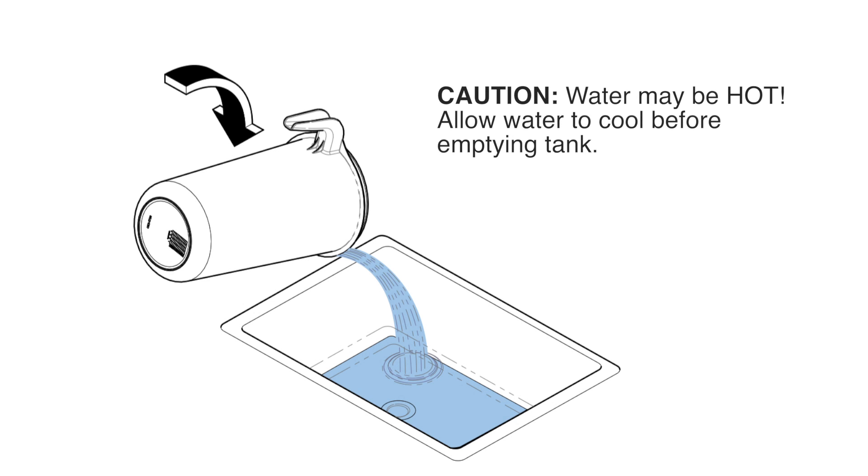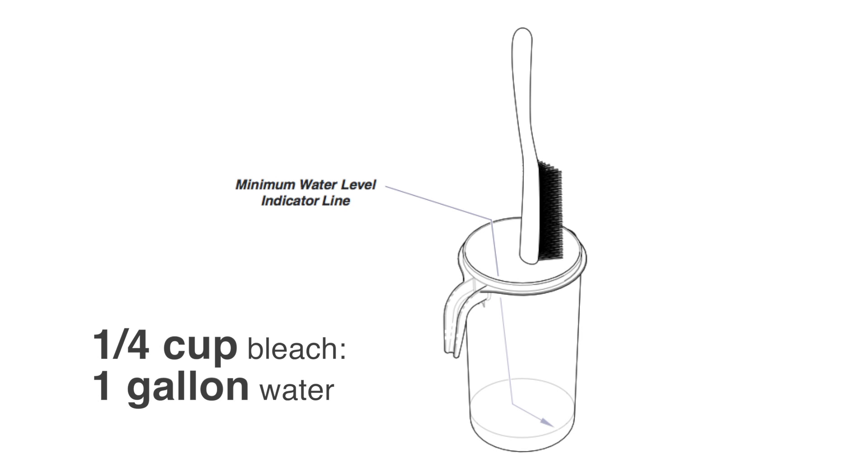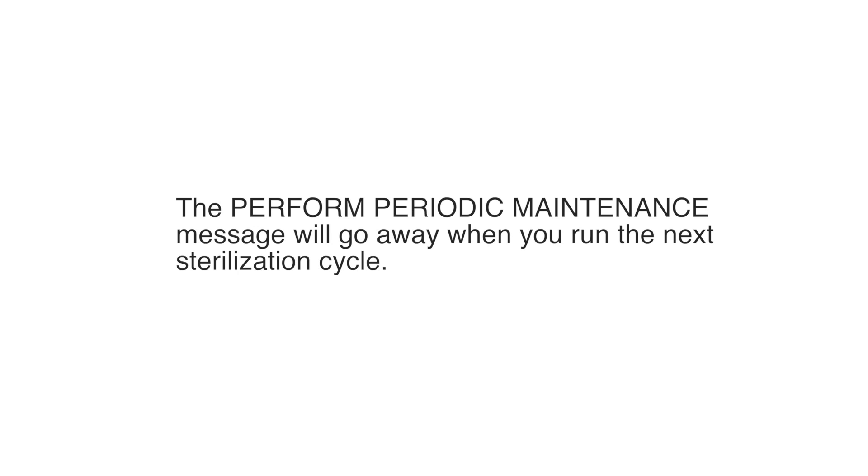Start by draining the external condensing tank. Do not reuse the water. Clean the tank with a brush and a diluted bleach solution consisting of ¼ cup of bleach to 1 gallon of water. Rinse the tank thoroughly, then refill the tank to the minimum water level indicator line. The 'Perform Periodic Maintenance' message will go away when you run the next sterilization cycle.